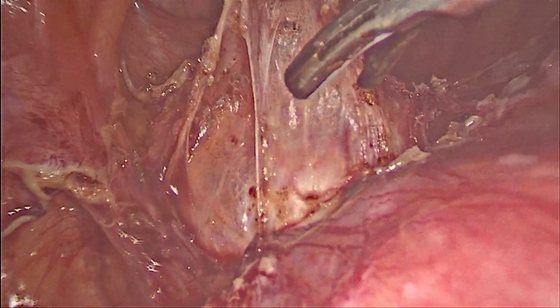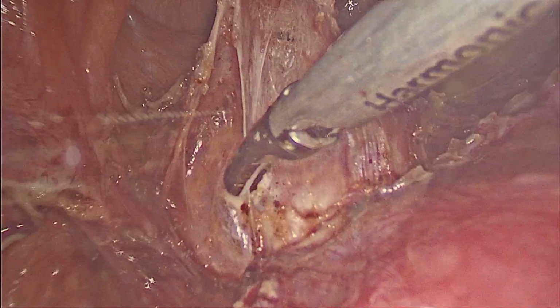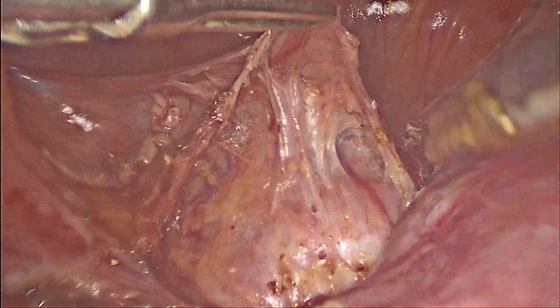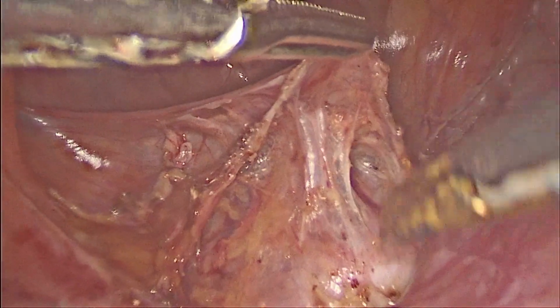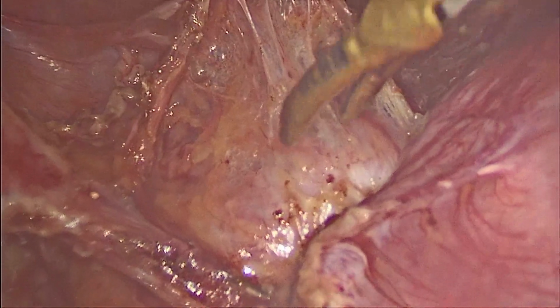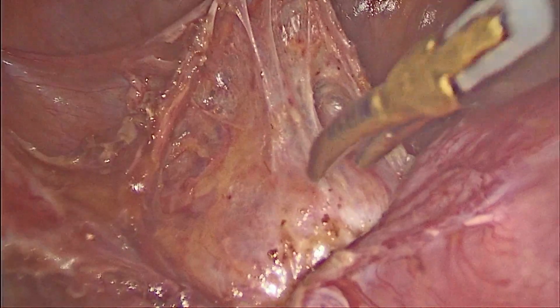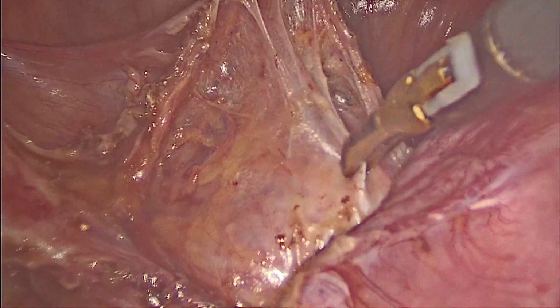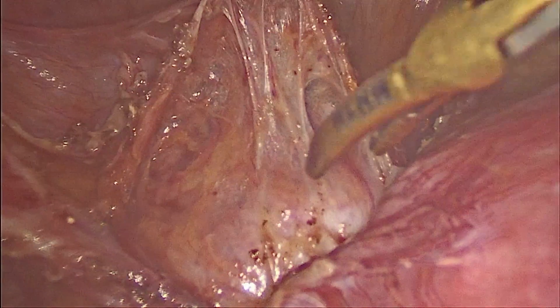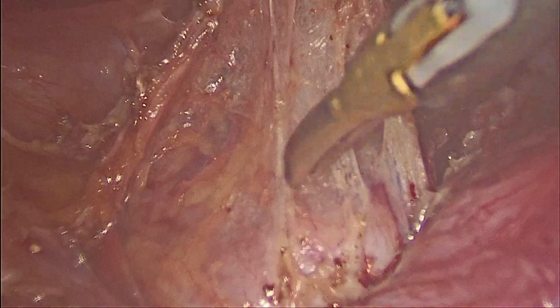Though we are seeing the proper plane between the bladder and the cervix, we are taking a little more time in confirming it, dividing all the fibers, and then getting exposure to the uterovesical fold of peritoneum, meaning the uterovesical space. So that is the loose cellular tissue we got between the bladder and the cervix.